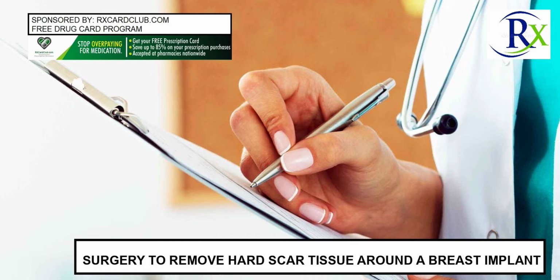Surgery to remove hard scar tissue around a breast implant. A capsulectomy is a surgical procedure to remove the abnormally thick, hardened tissue, capsule, that forms around breast implants, a condition known as capsular contracture. During this surgery, the breast implant is usually also removed and replaced.